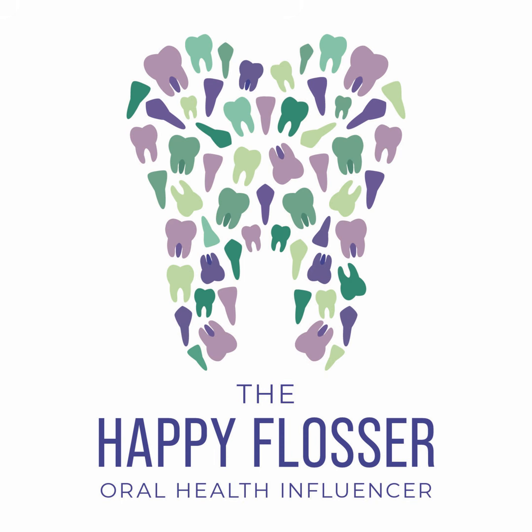So think about this. If the radiation cannot penetrate the metal, that means the radiation is not getting through the metal, so that is going to show up as white. The more easily the radiation can get through the object because of the density, the darker it's going to show up on the sensor. So places where there is nothing except air are going to be very, very dark on your radiographic image.